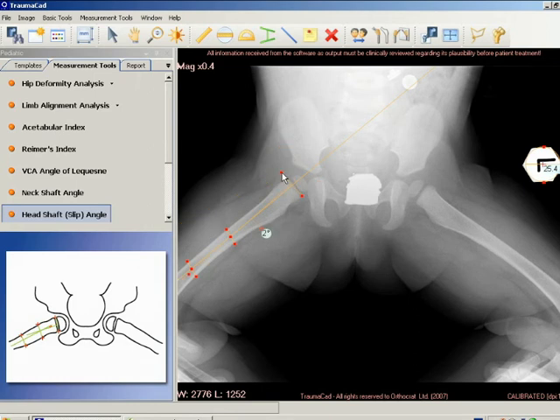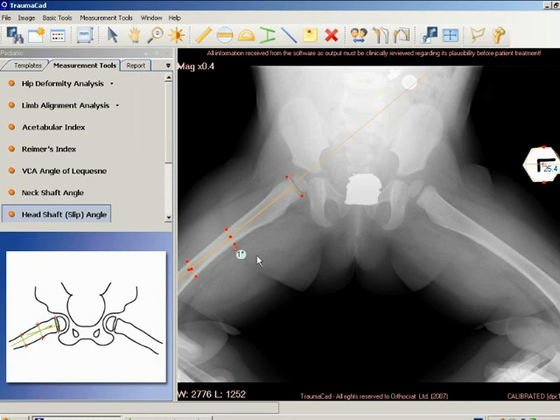Using the measurement of this angle, a slipped capital femoral epiphysis can be classified as mild, less than 30 degrees; moderate, from 30 to 50 degrees; or severe, greater than 50 degrees.